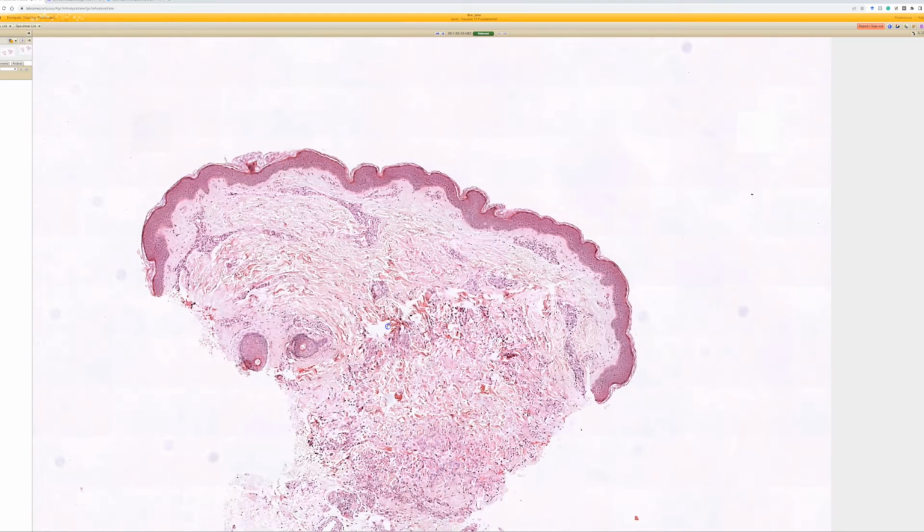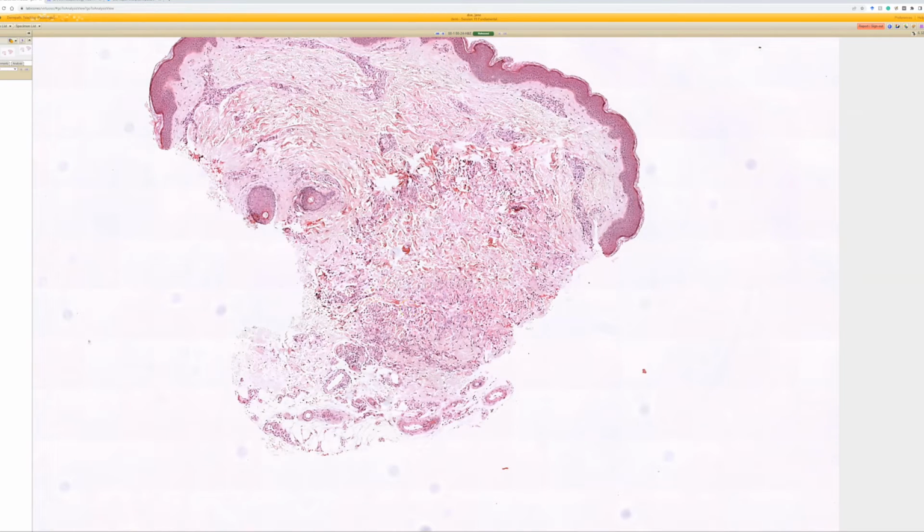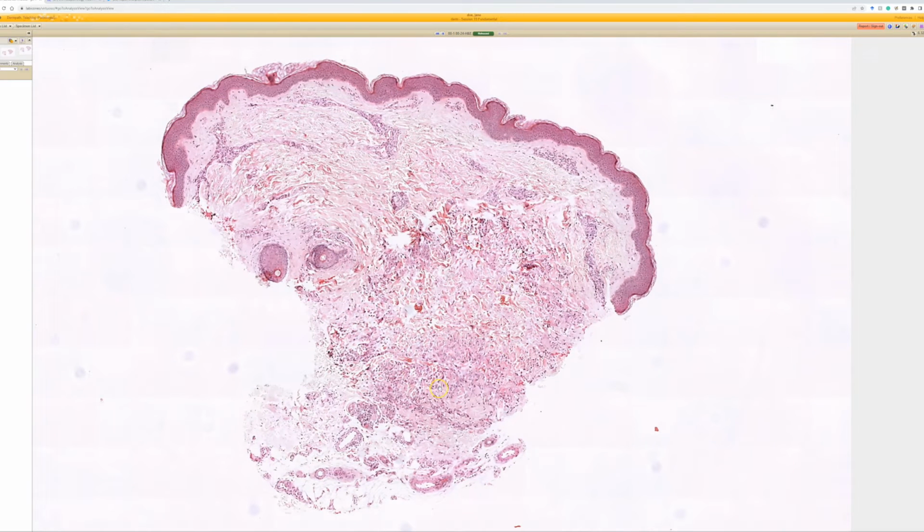All right. Sometimes granuloma annulare, though, presents just as papules, particularly on the dorsal fingers or dorsal hand. And so that form doesn't necessarily have a ring shape. And also there's a deep form of granuloma annulare that often presents as one or multiple nodules deep down in the subcutis on the lower extremity, usually of kids or young adults. And it will look like this, usually a lot bigger and more robust, and it'll be down deep in the subcutis a lot of times, and can sometimes mimic rheumatoid nodule.